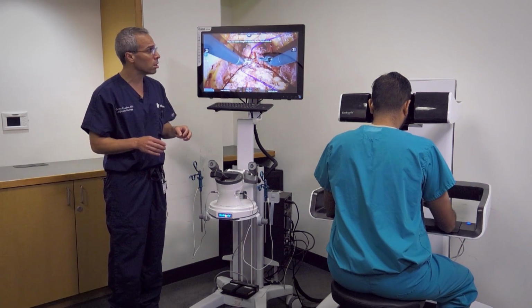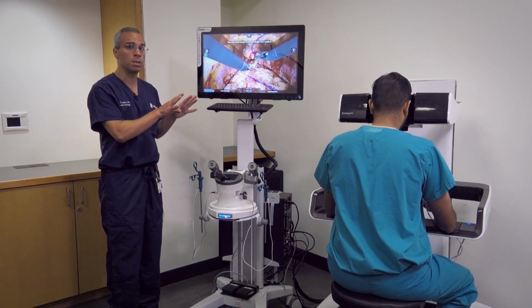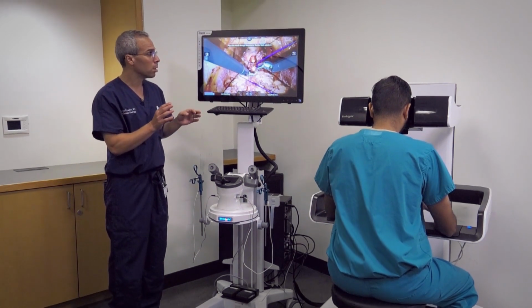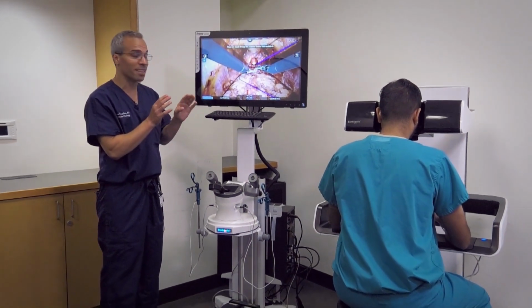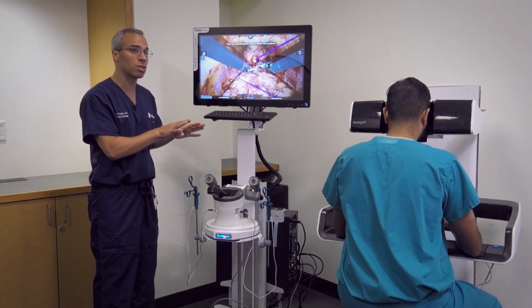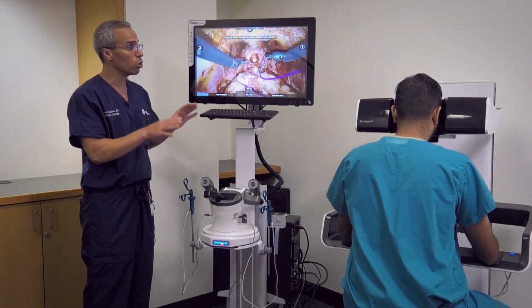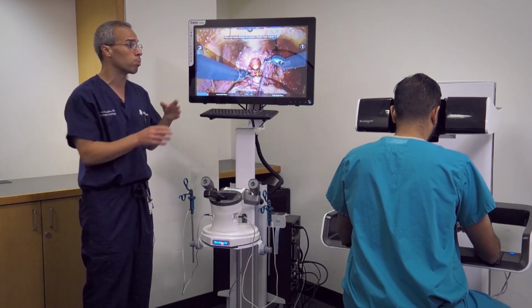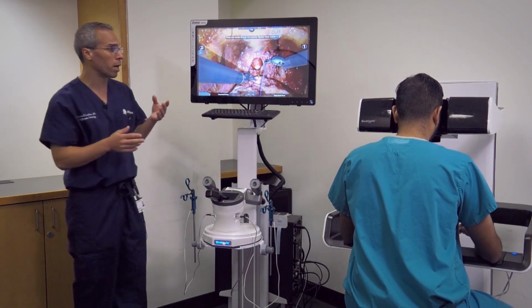And this is something that I would be teaching him in the operating room, right? This actual part of the operation. But again, the nice thing about simulation is that he can come, look at this, get used to it before he actually goes into the operating room. So practicing on a simulator versus practicing on patient.